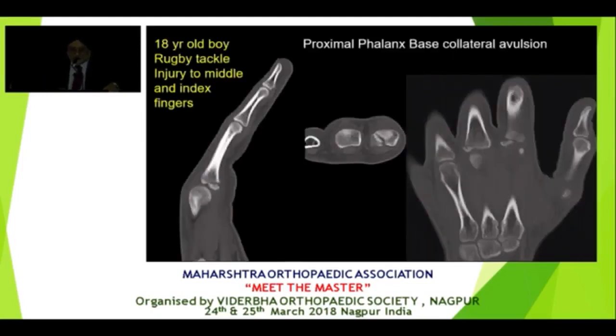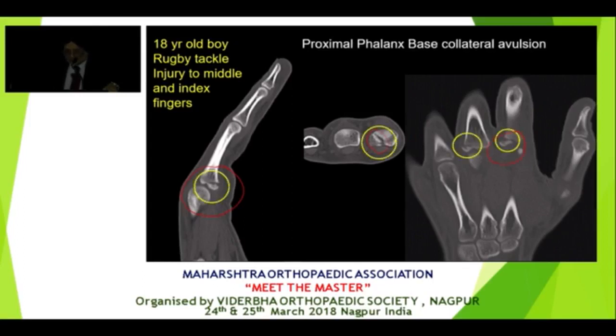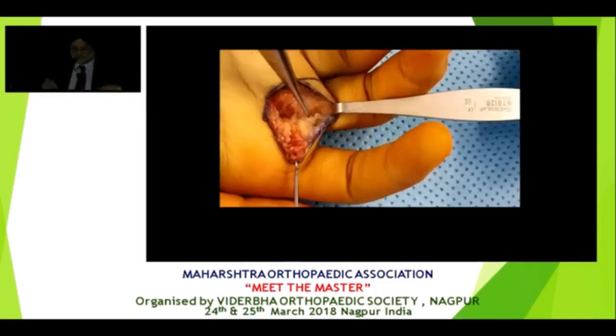Now this kid is playing rugby and he's pulled off his collateral ligaments because his fingers were pulled to the side. Now these collateral avulsions, if you look at it carefully, they're volar fragments. You see that? They're volar over there. So we use a little hook plate for that, or you can just use a pull-through suture. But the trick for this is to go on the volar aspect rather than the dorsal aspect.